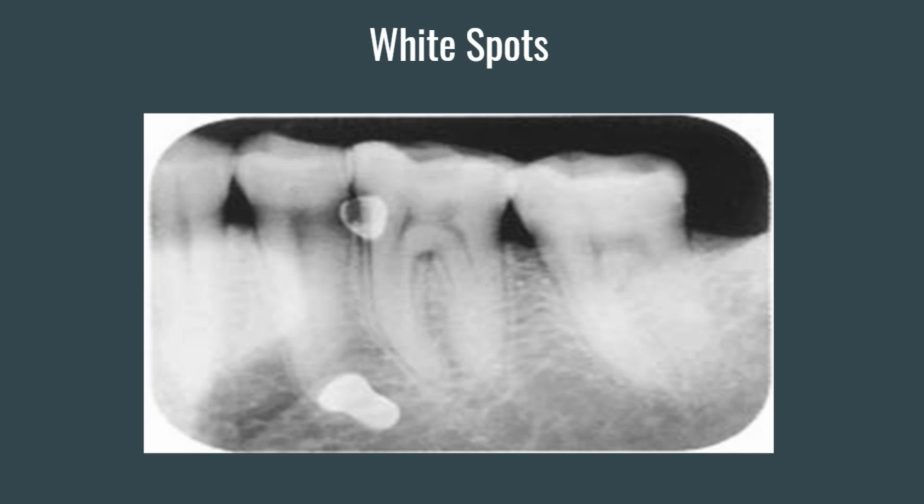And then opposite of that is the white spots. That's going to be caused by fixer. So this is fixer coming in contact with the film prior to it being processed. So similar scenario. Someone's replenishing the solutions, fixer gets on the workspace, it's not wiped up, someone sets the films down, it's developed, it's processed, and we have white spots on the film.